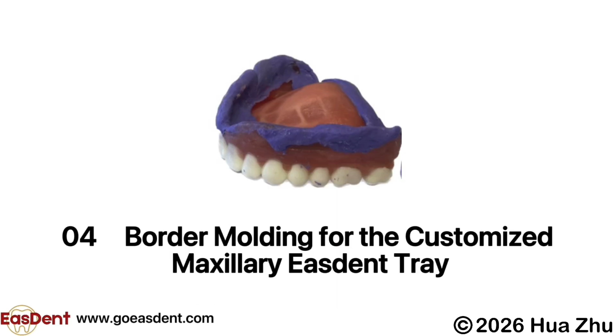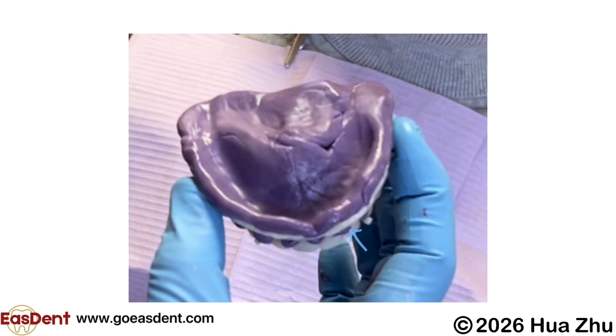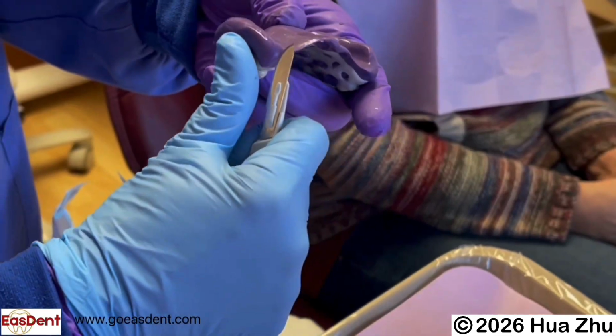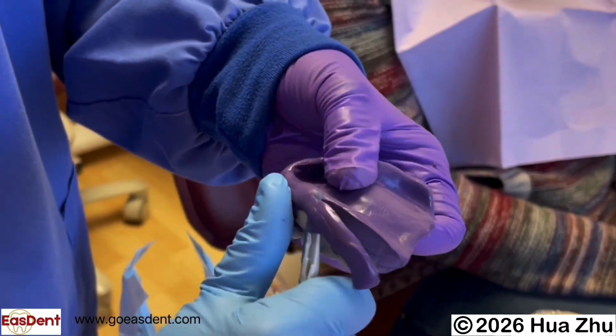Border molding for the customized maxillary Easdent tray. Check the borders to see if the border is too thick or you have overextension. Also check if the tray is showing through the putty impression material. When the border is too thick or the tray showing through the impression material, you have border overextension. Trim the areas thin and remove some extra material with a knife, a disc, or an acrylic burr.